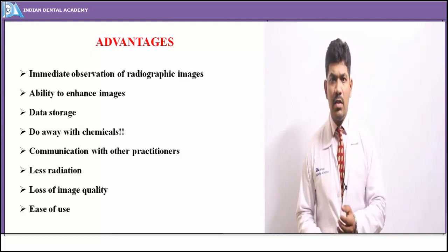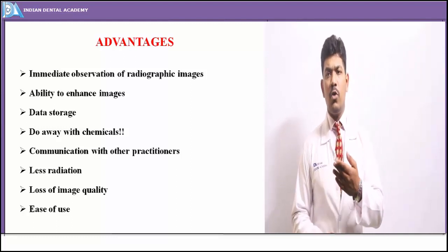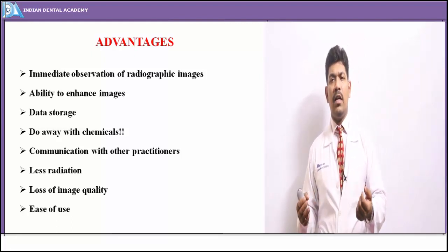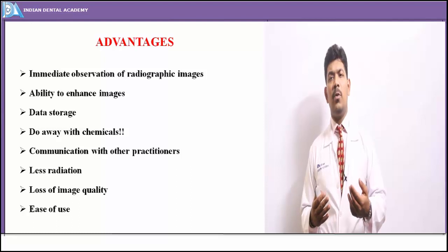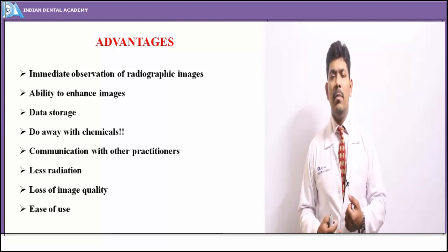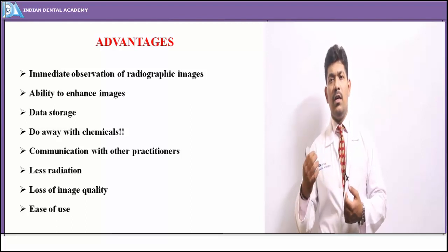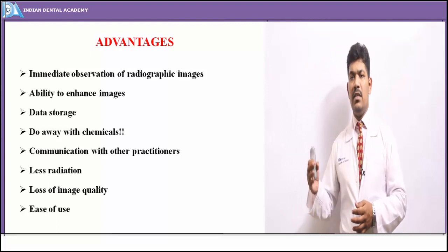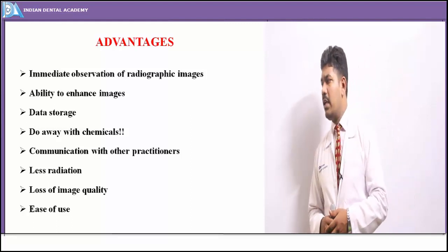Now, data storage. As I told you, these are basically soft copies. The soft copies can be stored for any length of time without any worry about image loss dependent upon the time. So this is data storage. As I said, you can do away with the chemicals totally.